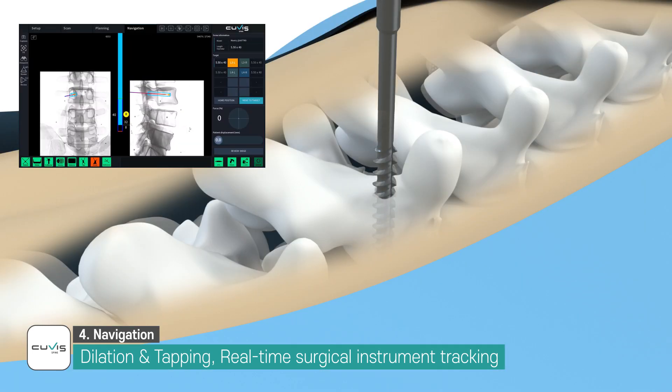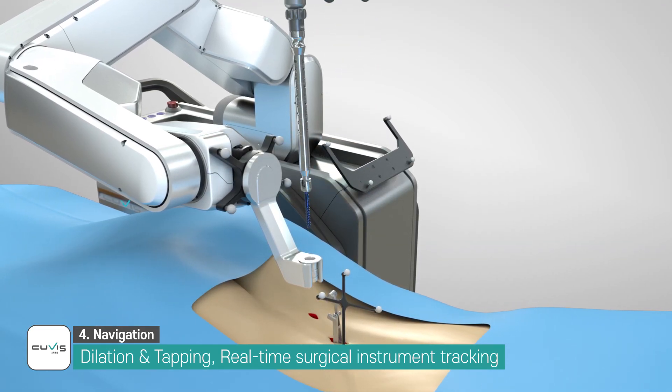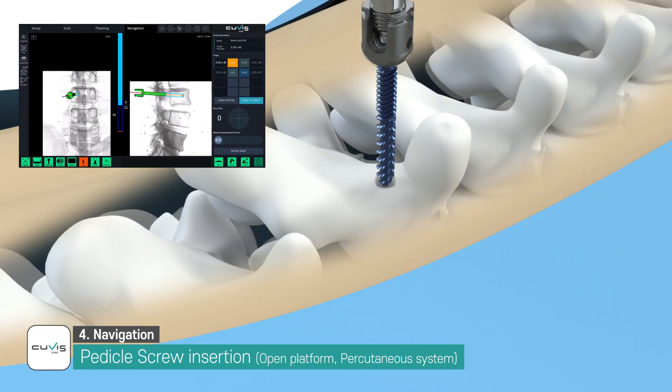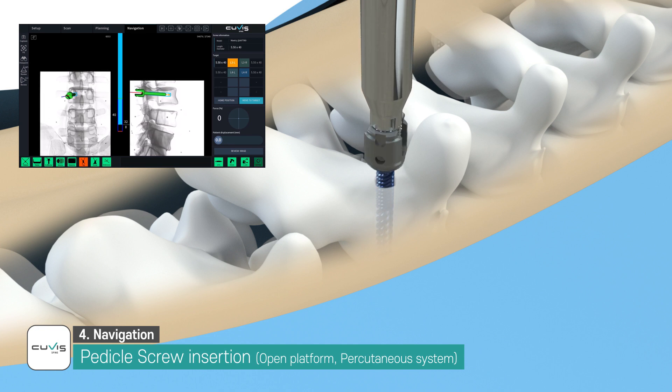The current position and orientation of the surgical instrument is displayed on the screen in real time. The navigation view also shows the depth at which the actual surgical instrument is inserted. The position and orientation of the pedicle screw is also navigated and displayed in real time through the marker tracking of the screwdriver.